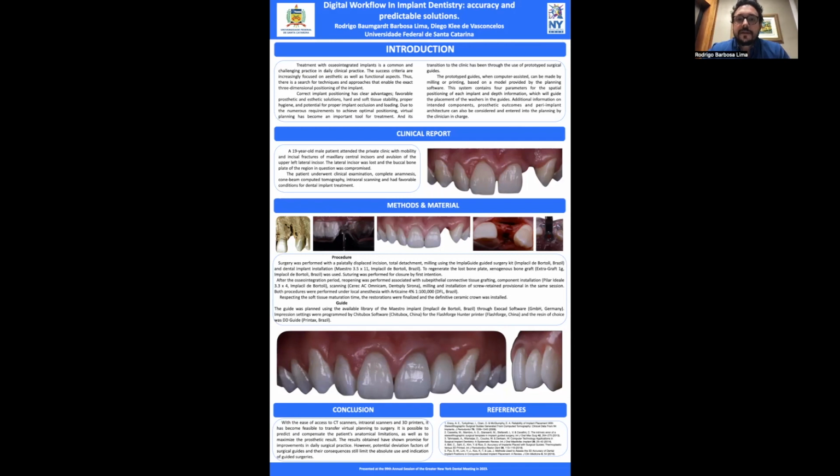wall. The implant of choice was a 3.5 by 11 Maestro from Implant as well, a Brazilian company. The bone regeneration was performed with xenogenous graft. Over the graft, we opted for a primary closure and provisional adhesive restorations.